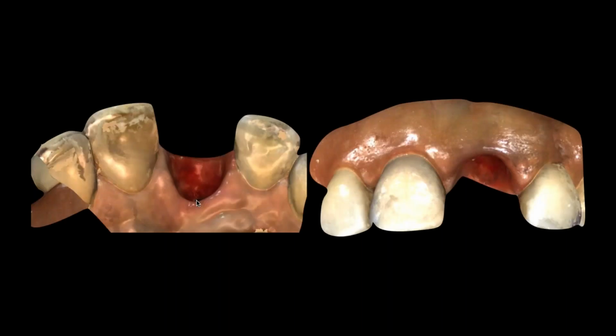Nowadays, with the newer scanners and newer software, we are also able to scan deeper into that socket, around 3 to 4 millimeters, without any problems, which makes it very, very helpful to capture the ideal emergence profile for the design of the restoration. The patient is not feeling any pressure, not feeling any pain, and that's also something very attractive, I would say, for the patient, because that restoration is designed according to this position of the soft tissue.